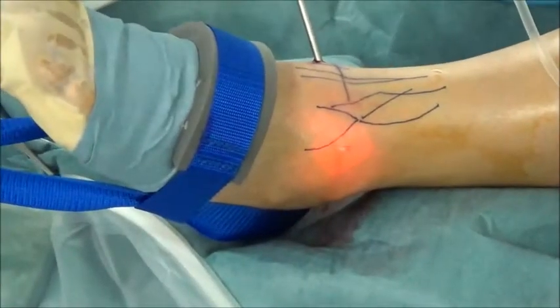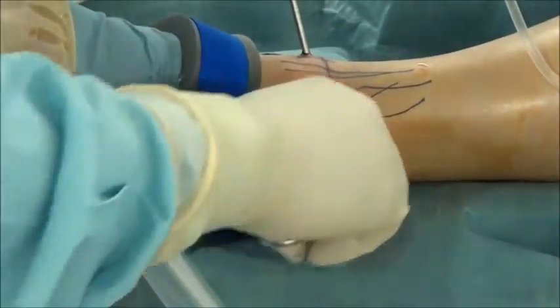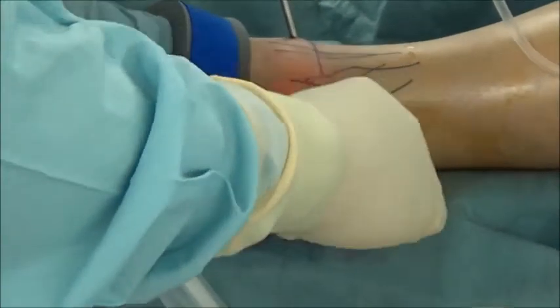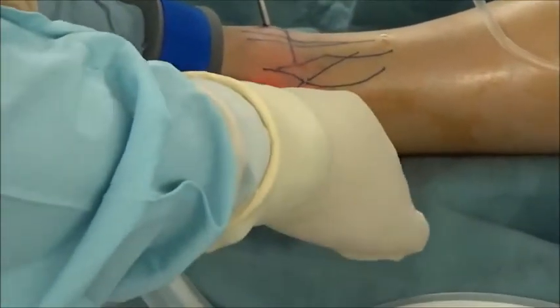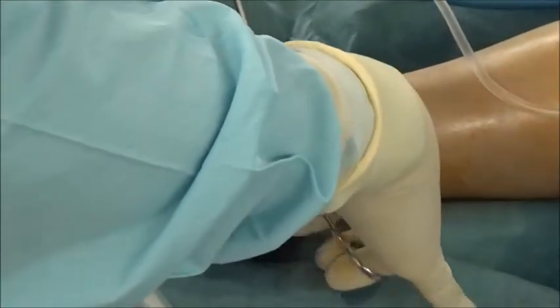As with the incision for the anterior medial portal, the incision for the anterior lateral portal was also limited to the skin alone. We used blunt dissection to penetrate the deeper layer down to the joint capsule.